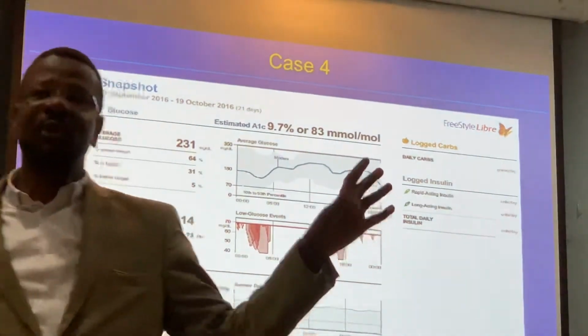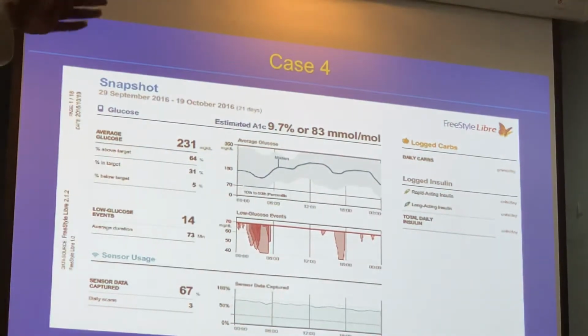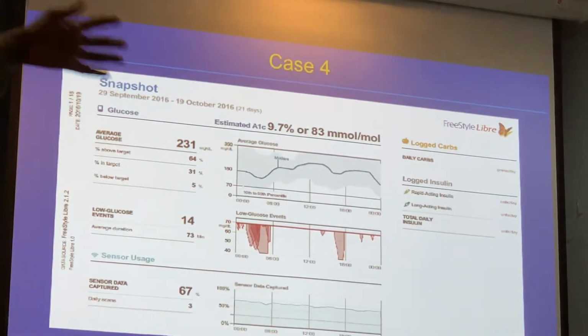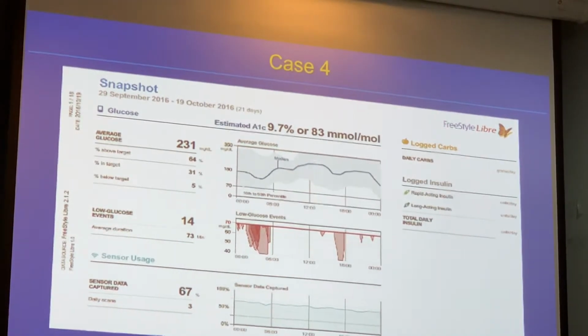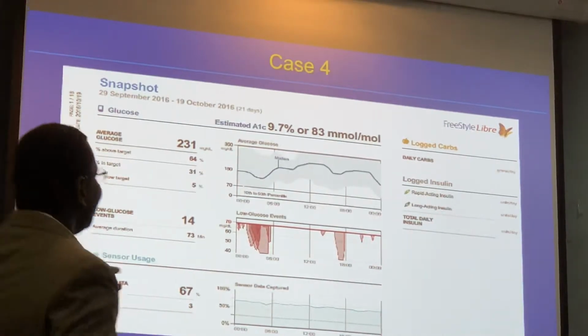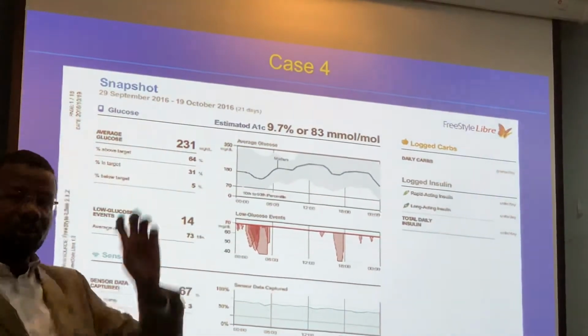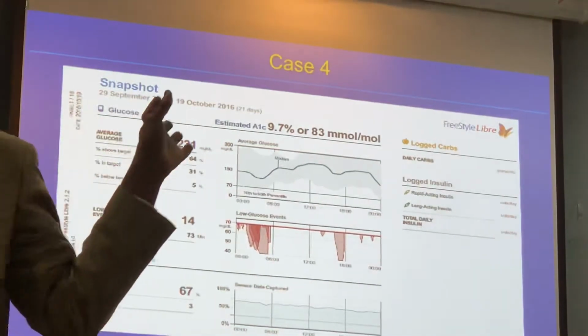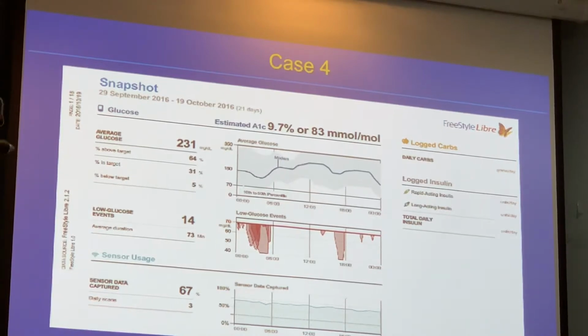So to address these problems, you need to first eliminate the hypoglycemia, and gently try to address the hyperglycemia at breakfast and lunch by increasing the prandial insulin, and so on, right? But if the percent below target is only 5, yeah, only 5, but still there is significant overnight. You see here there are 14 hypos. Although the Libre has limitations because it overdiagnoses hypoglycemia, right? But with that, like actual level, it will be acceptable to say that the major problem is fasting hypoglycemia, right?